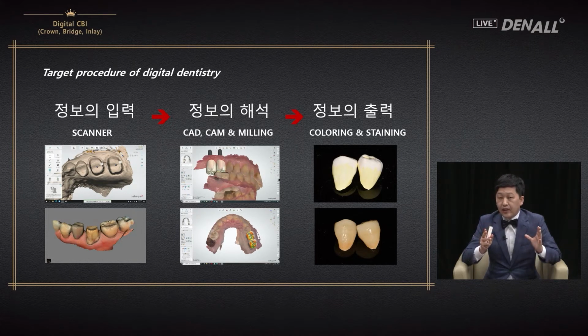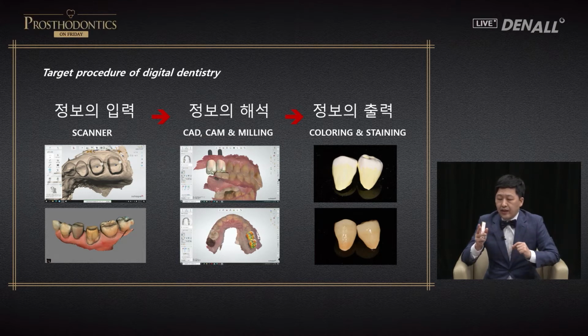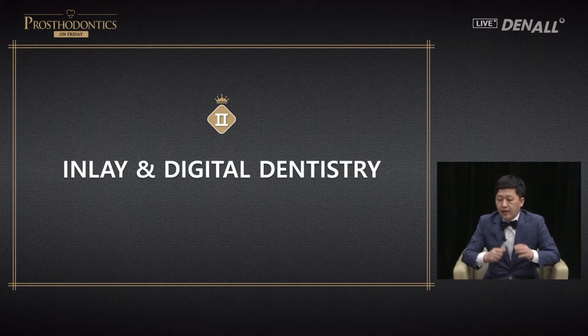If you want to utilize digital dentistry to the fullest, review what is done clinically. In input stage and in design stage, review what I have designed, and in printing stage, you need to check whether accurate color has been achieved. By doing this, you can get good result using digital dentistry.